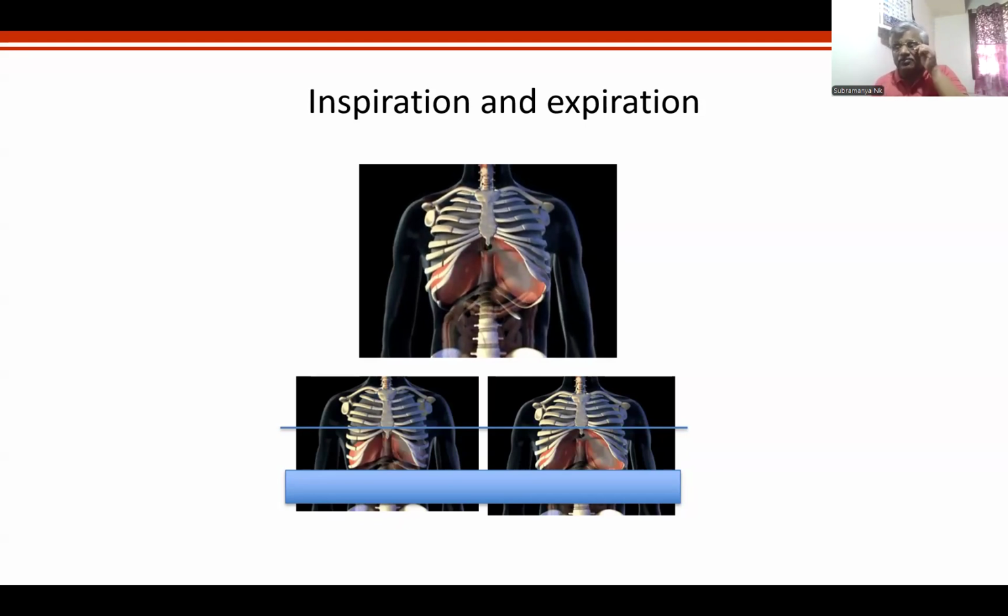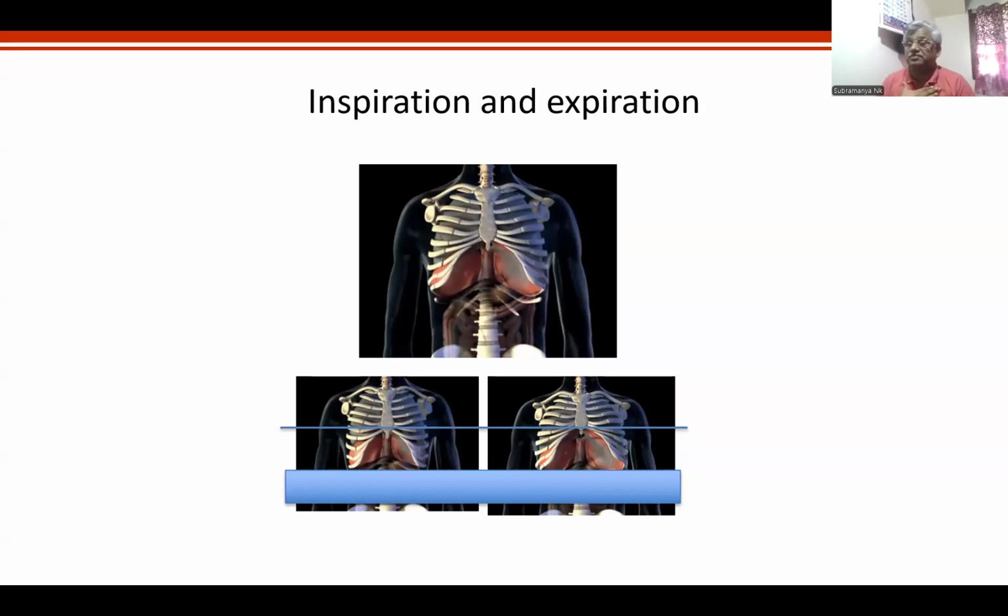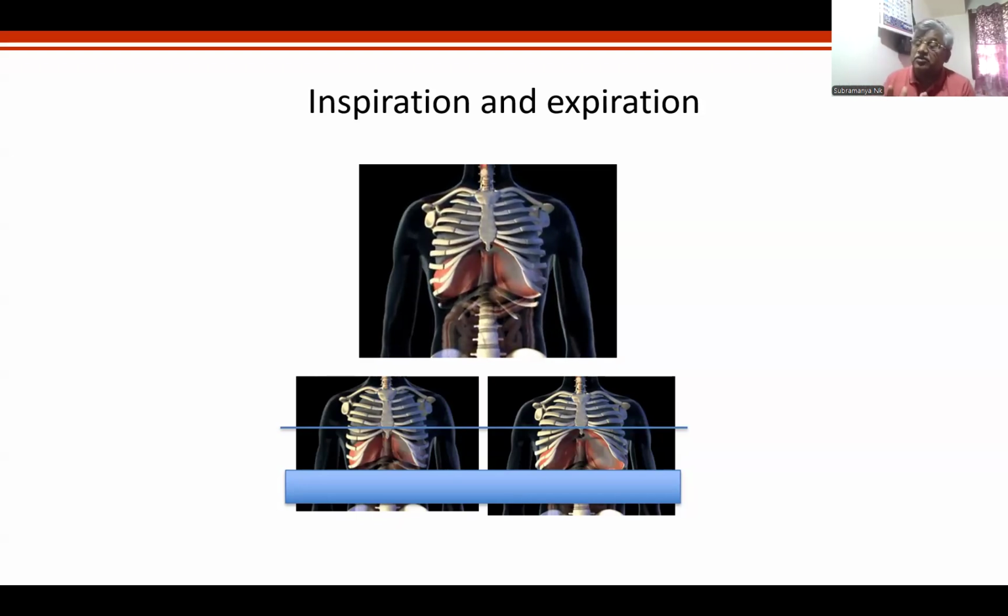Now, did I give you a beautiful comparison as to when to take a lateral X-ray and when to take a CT scan? This is an important dilemma. All of you face it. Please don't tell me no. I have faced it, and if I have faced a problem, you will also face it. This workshop is not about just telling you something, giving you a collection of X-rays. It is about giving you an insight and an approach as to how you should go about ordering an X-ray. This is very, very important for you.